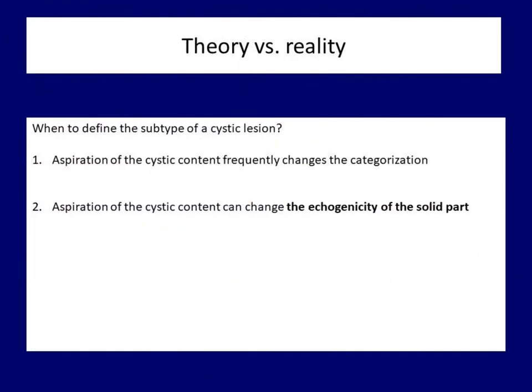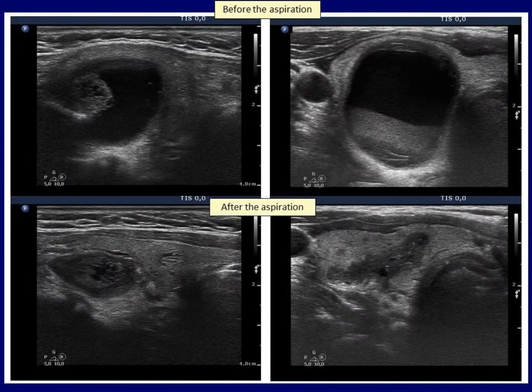The second and more important problem is the echogenicity of the solid part in cystic nodules. It is well known that cystic fluid amplifies the echo signal, therefore the solid part dorsal to the fluid appears more echogenic than it is. In both cases, the solid part became darker after aspiration. In the left case, this had no practical relevance because the solid part was hypoechoic even before aspiration. In the right case, however, the change in echogenicity had a major effect on nodule categorization: the nodule would be classified as benign or low risk before aspiration, but after aspiration, all guidelines would group it among the most suspicious category.